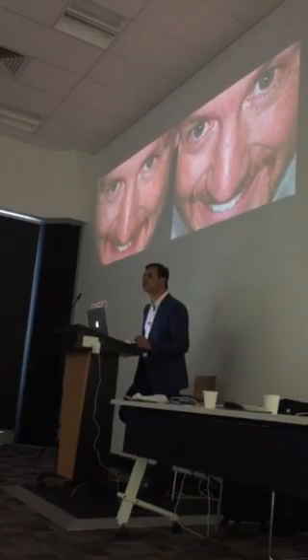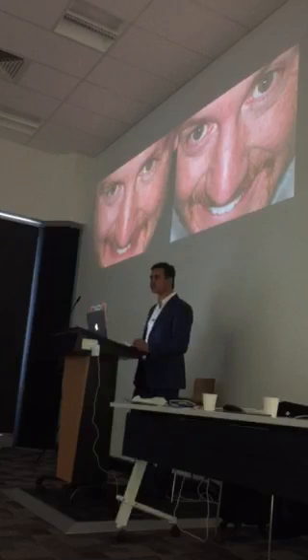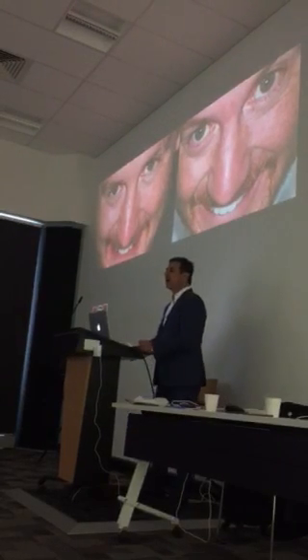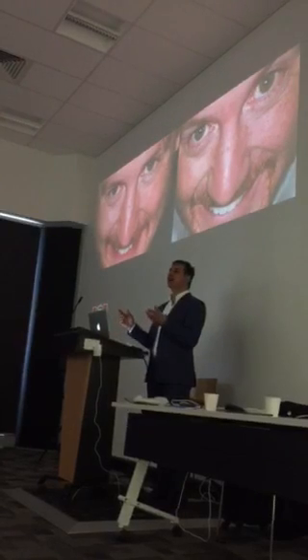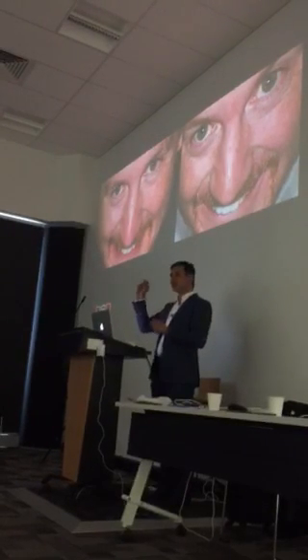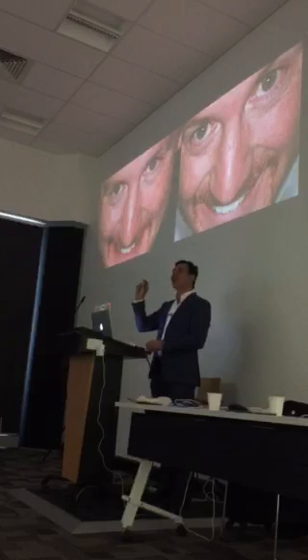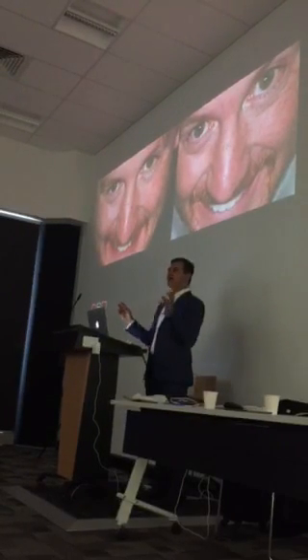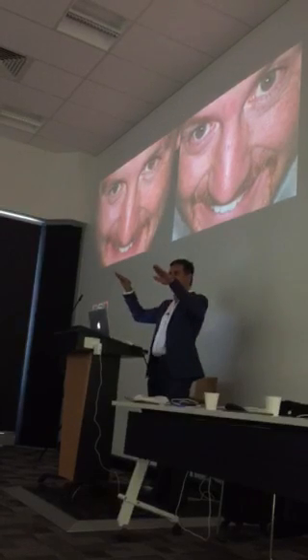Yes? Just ask a question. Sure. If you've got excess tooth where you actually want to remove that tooth, how do you plan? So usually you see that in canines, canine tips, and we'll show you a little trick. Use blackout markers. So often, and I've got a case where I've got the canine hanging down, but I wanted to show the ideal canine.